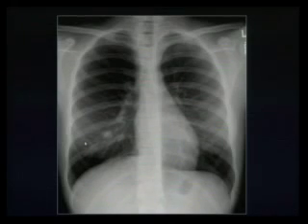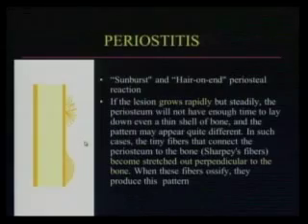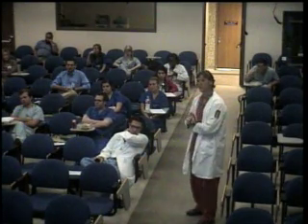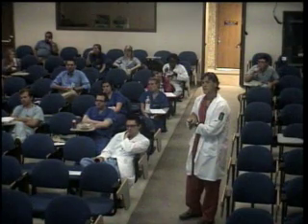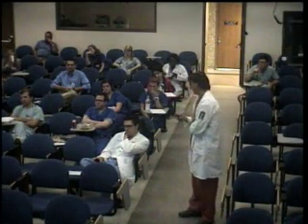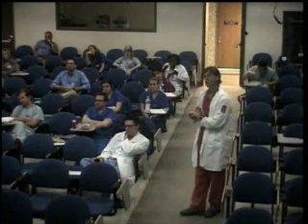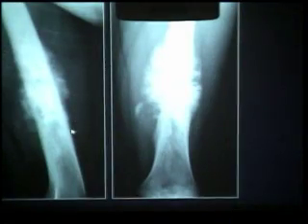Laminated pattern is also malignant or aggressive. Yes, the Ewing sarcoma, yeah, the prototype, right? Yes. All right. Ewing sarcoma usually does not form bone, so you will not see osteoid matrix around the lesion, okay? You will see more laminated pattern. But in any aggressive lesion, you may have this pattern.